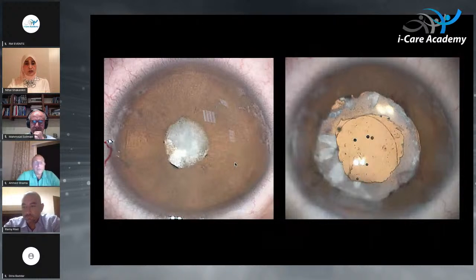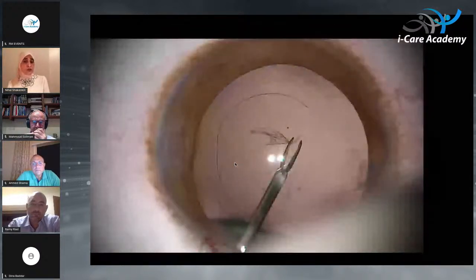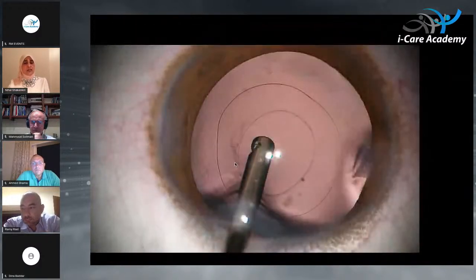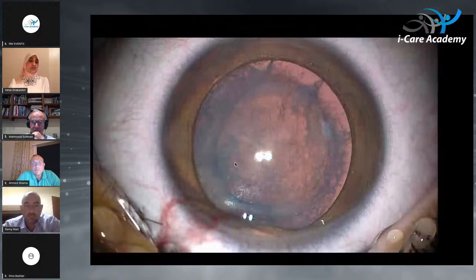In cases of cataract after intermediate uveitis, usually it's very simple when we work as a team and there is good control of the uveitis. It looks like a very simple case of pediatric cataract: 5 millimeter anterior rexis and 4 millimeter posterior rexis, vitrectomy and implantation inside the capsular bag. It looks like a simple case of congenital cataract. And this is a case of uveitis, actually it's a steroid-induced cataract.